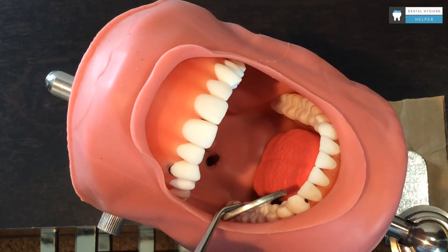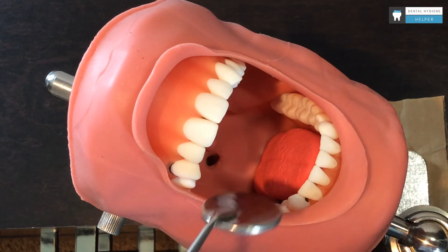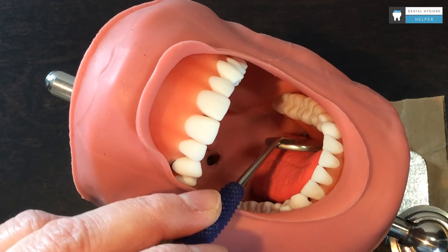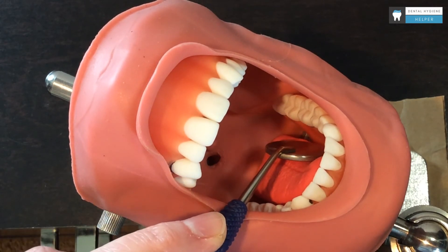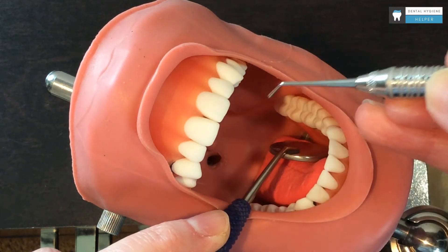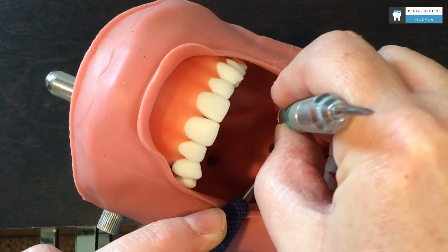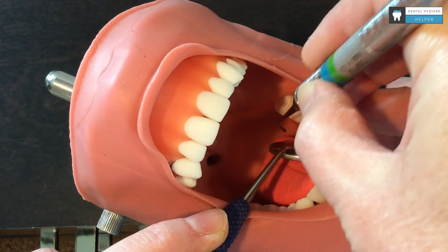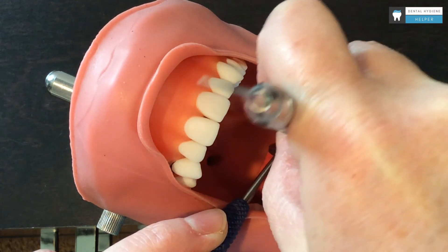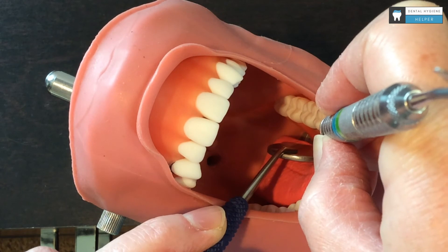To do the opposite side, which I can also do from the 9 o'clock position, I'm going to use the side of the mirror to retract the tongue. I can also scooch back on my instrument a little bit, and as I reach to the back, I am fulcruming kind of on the premolars at the moment, and move forward.